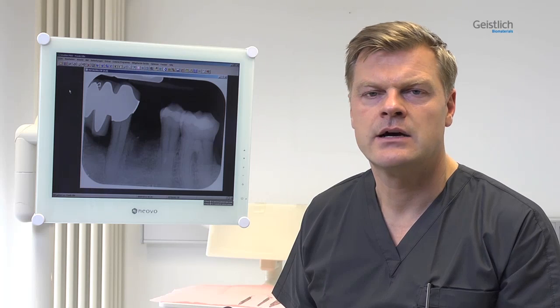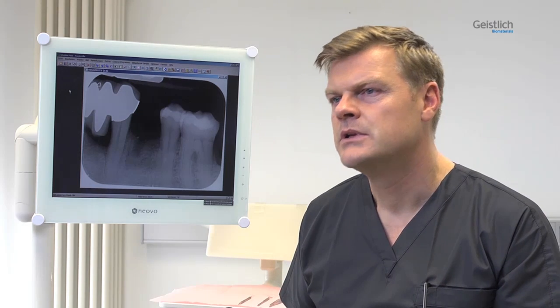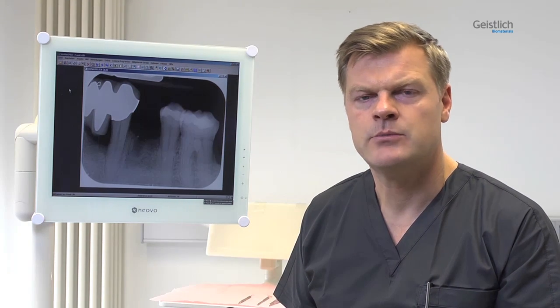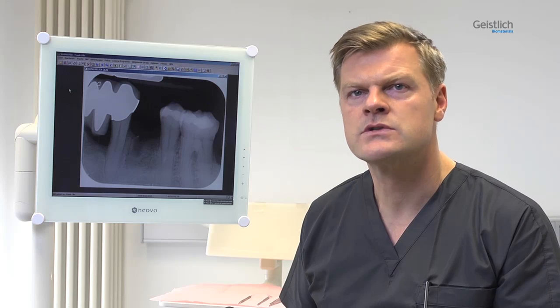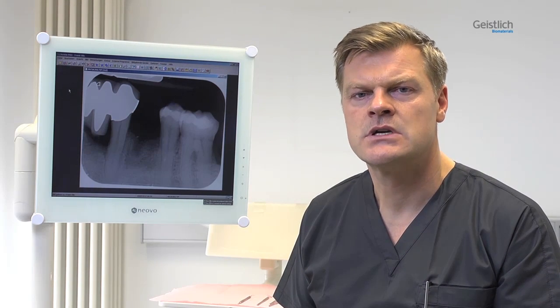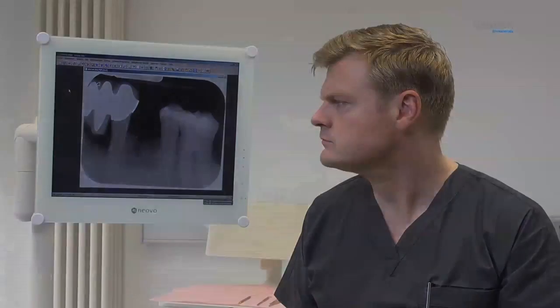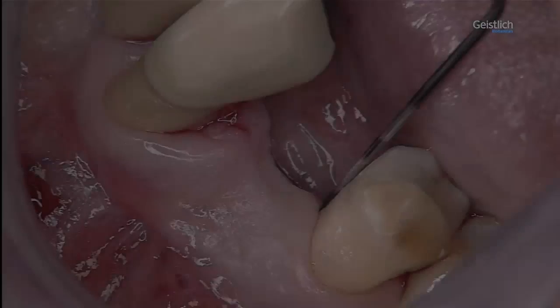At today's appointment, an implant will be placed at site 3-4. To compensate for the ridge defect, we will perform a minor augmentation with autologous bone and bone substitute material. The augmentation site will be covered with a membrane in accordance with the principles of guided bone regeneration.